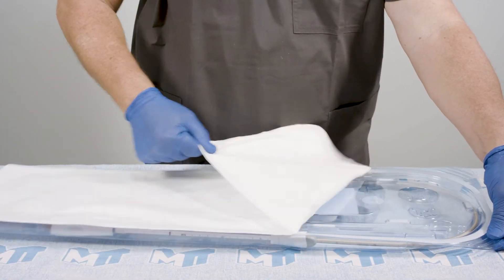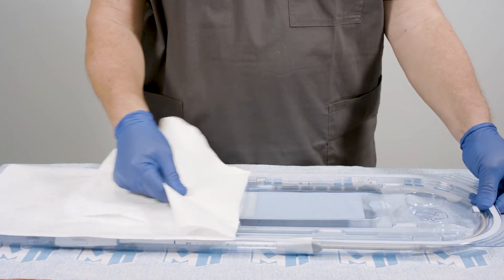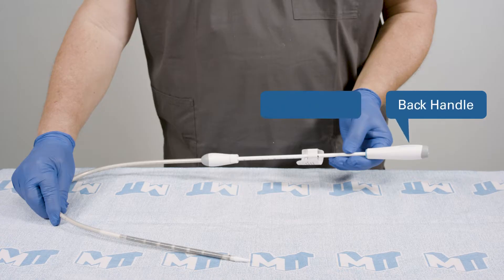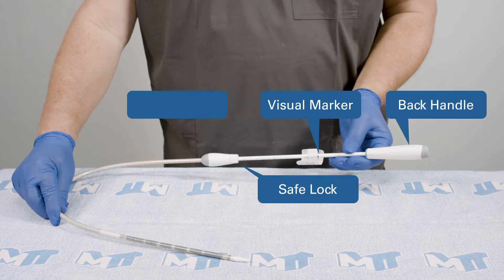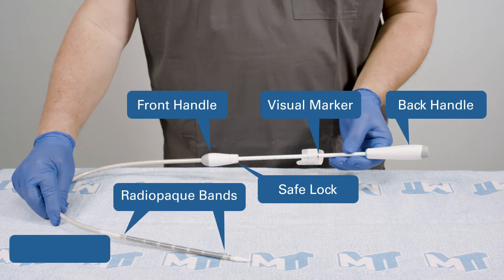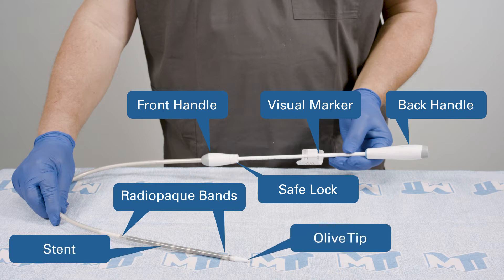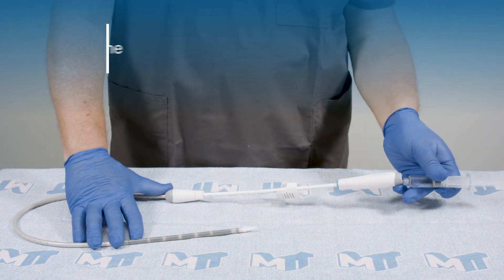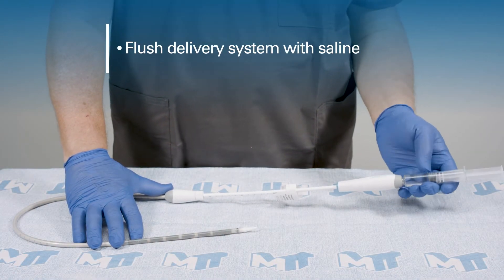Pull back the lid to gain access to the tray. After opening the packaging, flush the delivery system with saline.